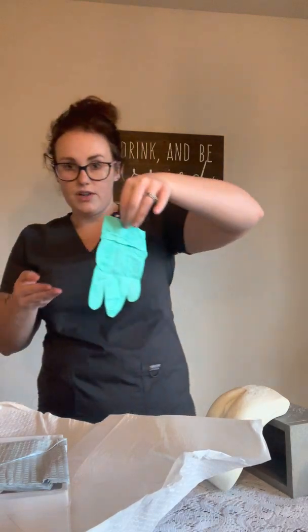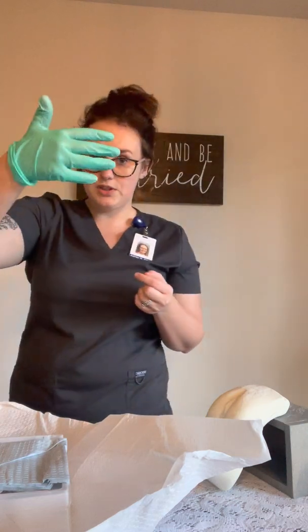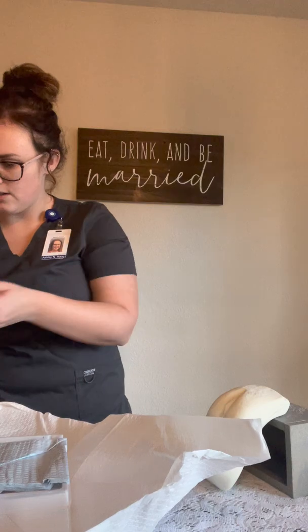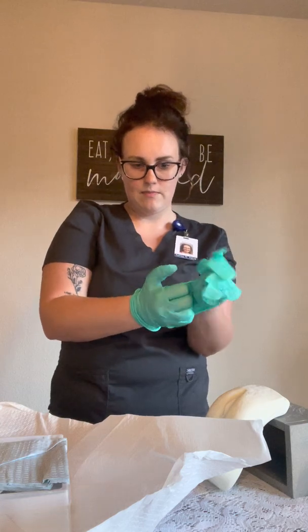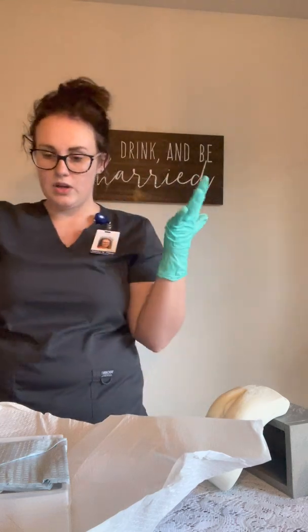I'm just touching the very bottom corner, placing it on here. I'm going to use this part of my hand to get underneath the cuff so that I'm only touching sterile to sterile. Apply the glove, and then I can go ahead and fix this one too.